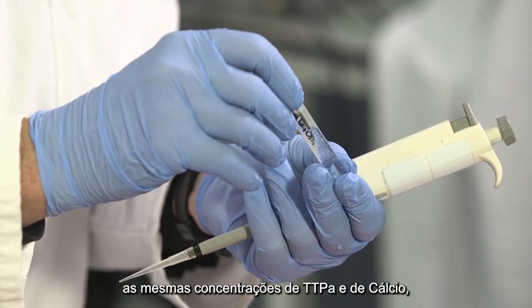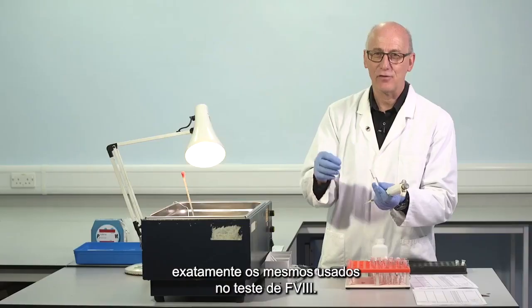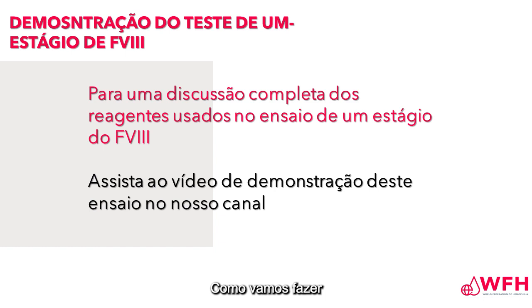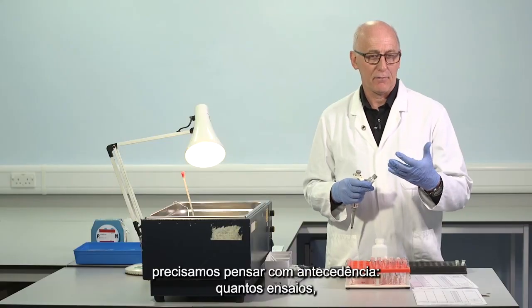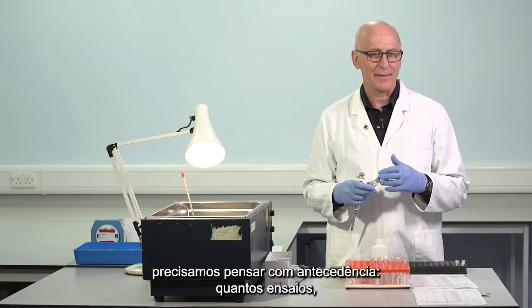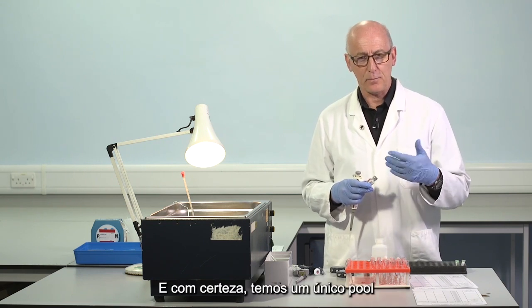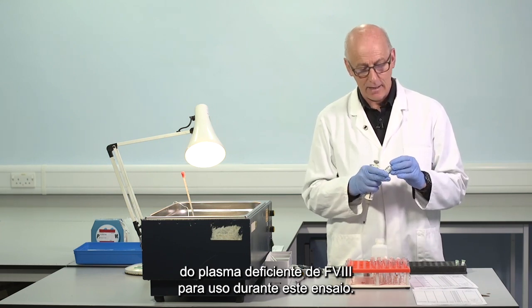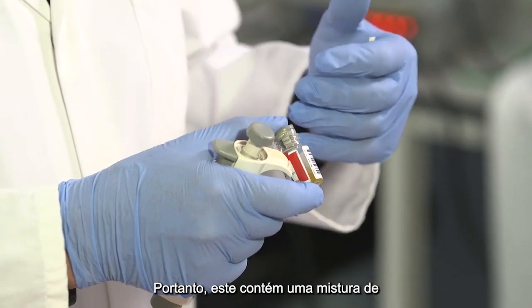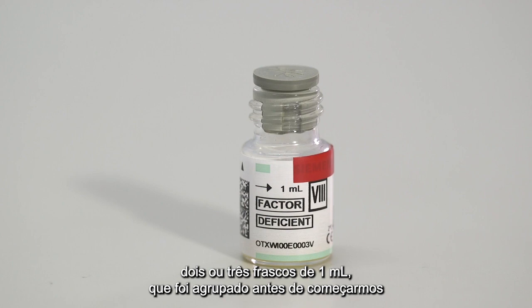And these are exactly the same APTT and calcium concentrations as used in factor VIII assays. Since we'll be performing a series of factor VIII assays, one on each of these mixtures, we need to think in advance how many assays, how many tubes, and what volume of factor VIII deficient plasma. We need to be sure we have a single pool of the factor VIII deficient plasma for use during this assay. So this contains a mix of 2 or 3 vials of 1 ml, pooled before starting.